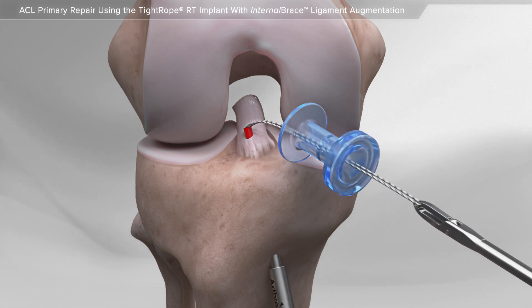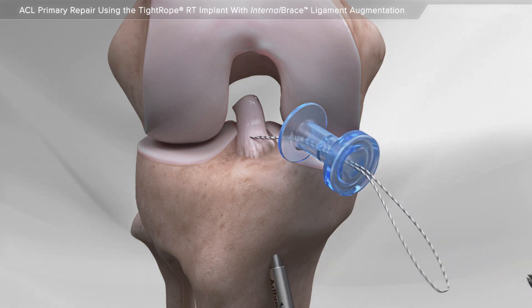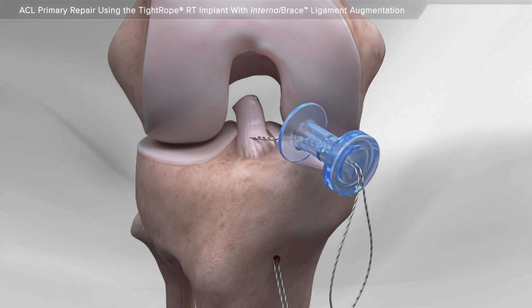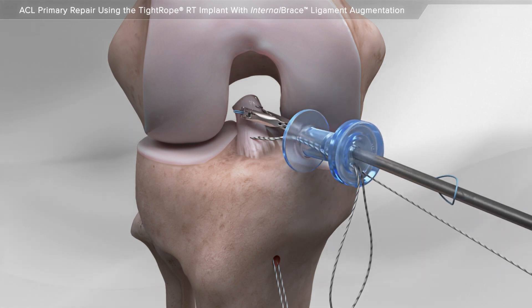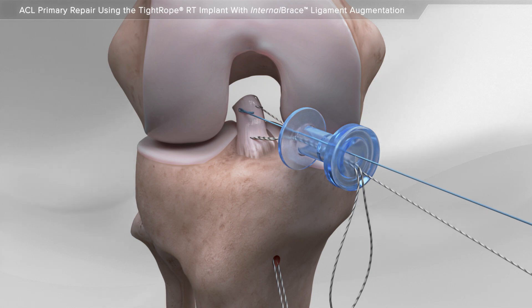First, the suture is placed in the intact healthy portion of the ACL. And two additional repair sutures are passed through the ligament that is torn away from the bone.